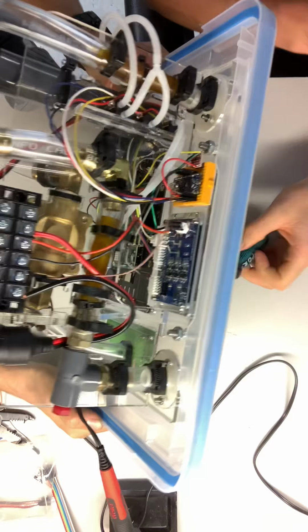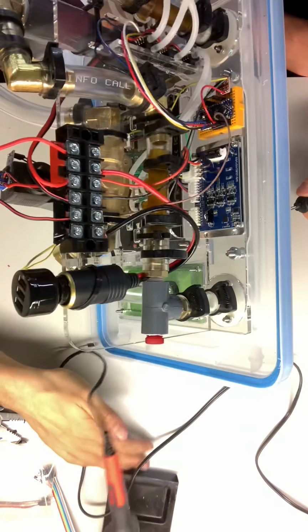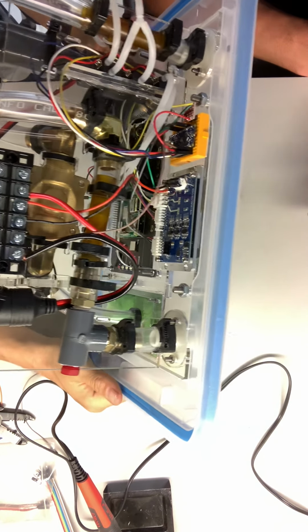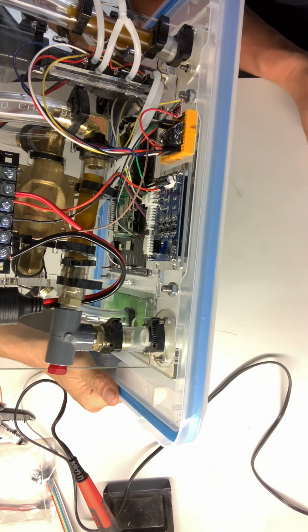Which is powered by the input 12 volts. So that's probably sufficient ground. We don't need a ground direct from the RPi. I mean, it could, if we see trouble, we can ground it more. But I think for now, it's okay. It does have a ground path. Sure. Well, that's great then.